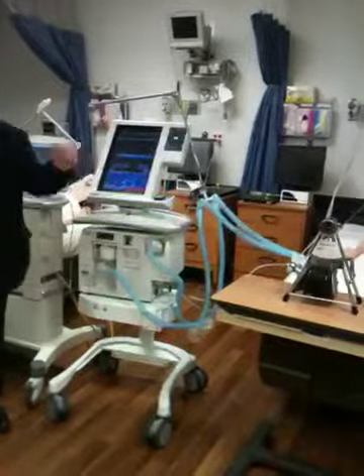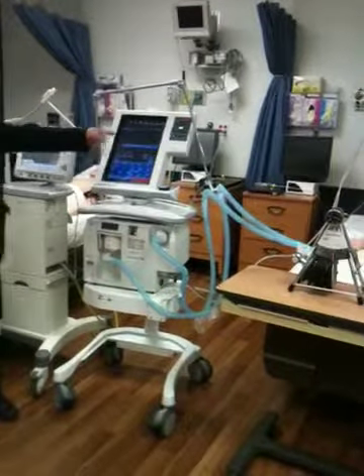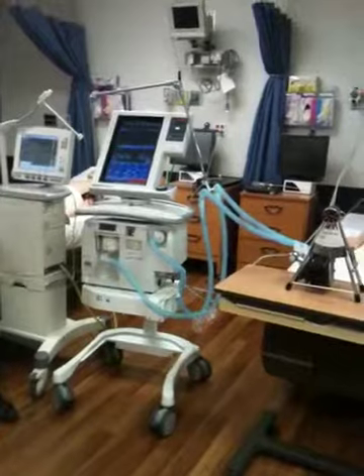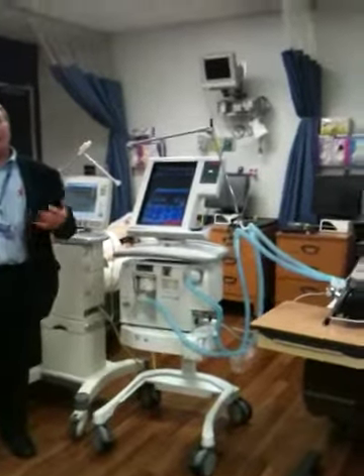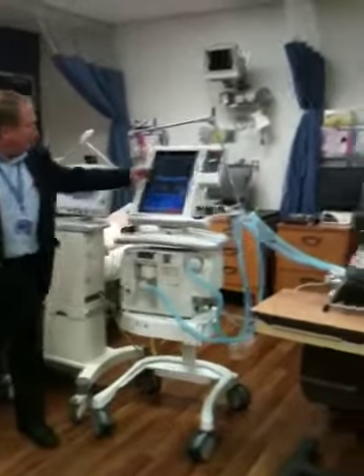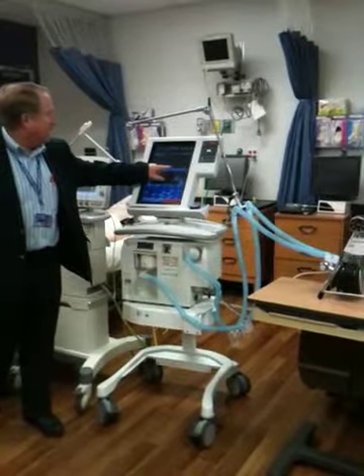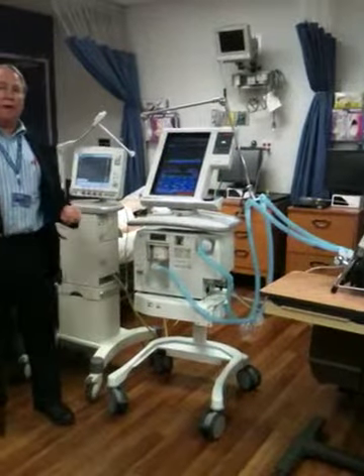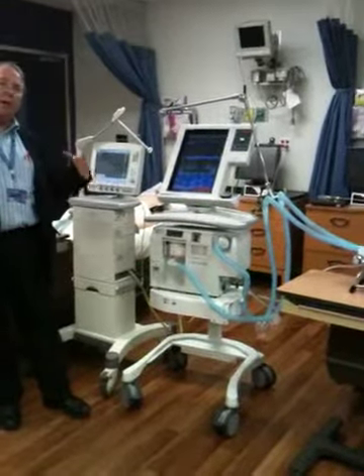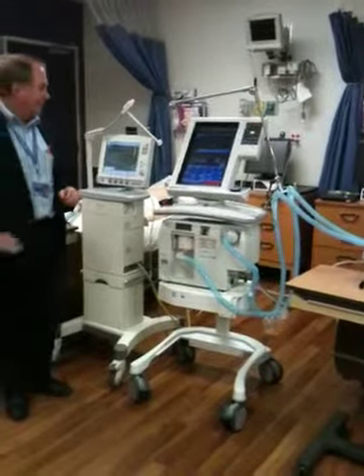I gave him a bronchodilator and his airway resistance went down. It changed the shape of the flow volume curve. When we do pulmonary functions, that's what we're going to be doing. We're measuring each other's peak flows, and the peak flow is this peak right here at the dot. And then it should be a nice gradual drop down. If not, then I'm showing that the airways are closing as we're trying to exhale.